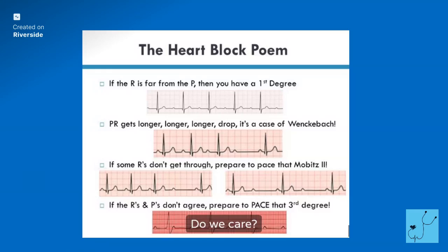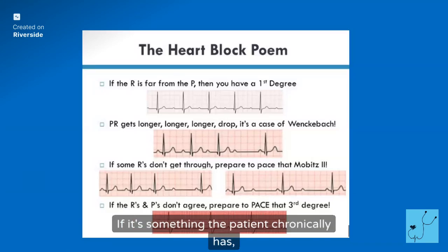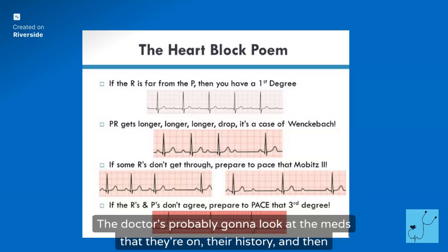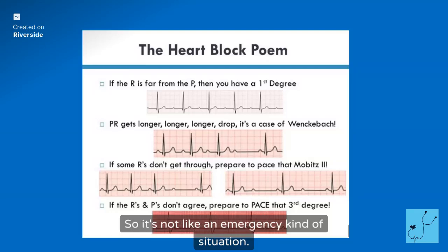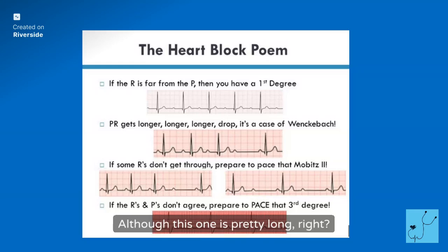Do we care? I don't know. It's something to note. It's something to document. It may or may not be a problem. If it's something the patient chronically has, the doctor's probably going to look at the meds that they're on, their history, and then we're just going to watch it. So it's not like an emergency kind of situation. Although this one is pretty long, right?